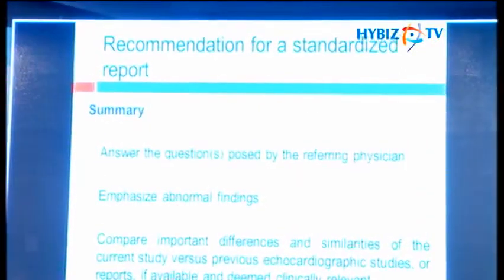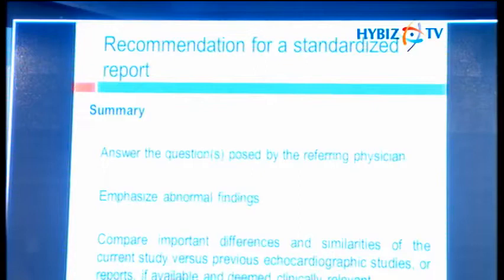So to summarize, we should answer the questions asked by the referring physician, which is not seen in our country, and emphasize all the abnormal findings. And if we can compare with the previous echo findings, that should also be mentioned in our echocardiography report.